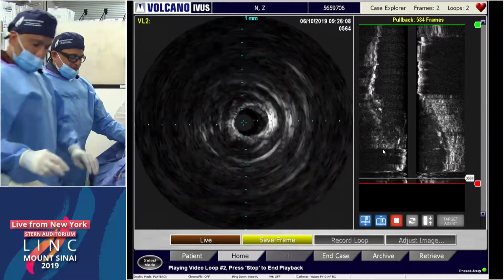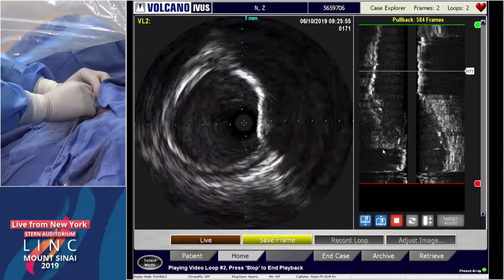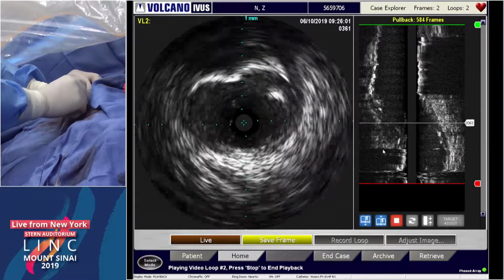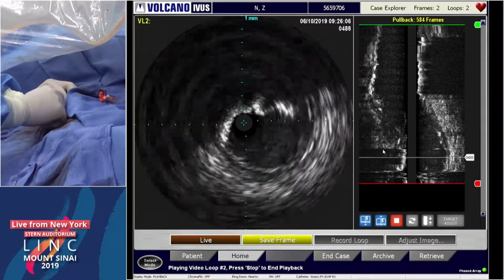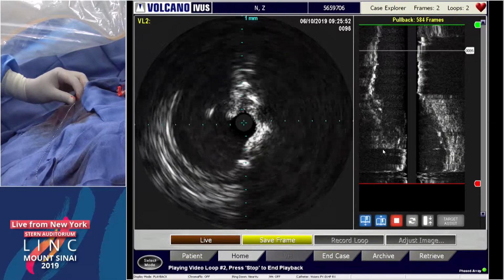And also, just a point to that, I completely agree with Dirk and Dr. Bachrach's point. It is a good point. If we had a good stent in America, at least, I know in Europe you guys are so lucky you get these stents a little early. But here, we'd be putting a stent that really does not belong in this area. And I think that's my hesitation. I think that's good right there. So PK, I just want to comment.